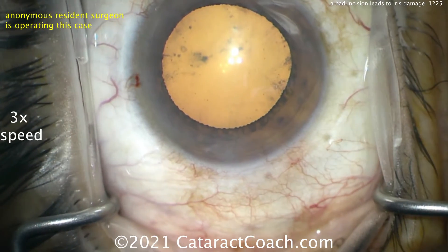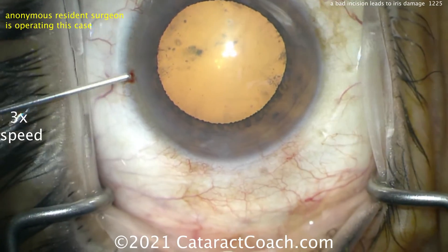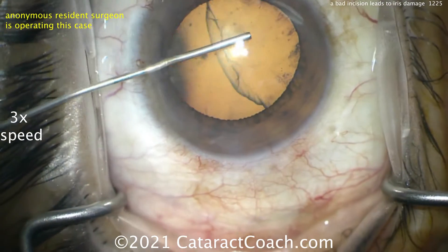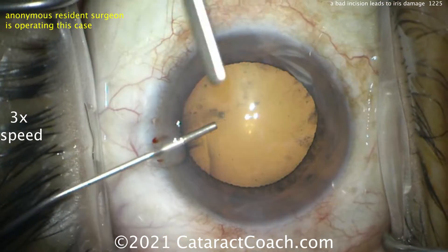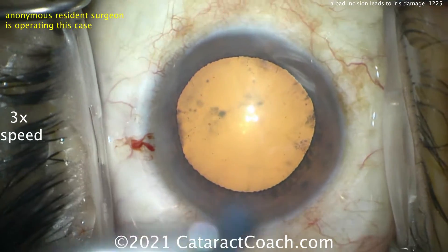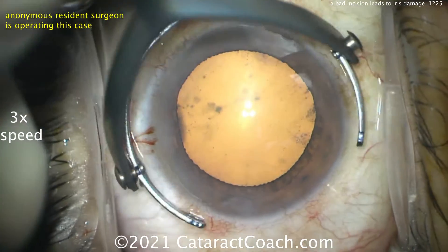Going to put the viscoelastic in the eye — dispersive viscoelastic coming up shortly. Remember, we want a normal physiologic IOP of about 20 millimeters of mercury; that allows you to make a better incision. So check that pressure, get it normal. That looks great. Now here comes the main incision, and this is going to be the problem, so slow down the video.